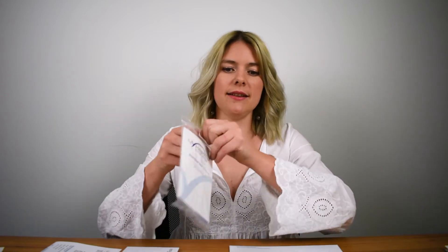Let's go ahead and open up the sealed sample collection kit. It contains a resource card, step-by-step instructions, a dried blood spot card, a small envelope, two safety lancets, an alcohol wipe, a gauze swab, and two band-aids. It's very important that you follow these instructions as closely as possible.